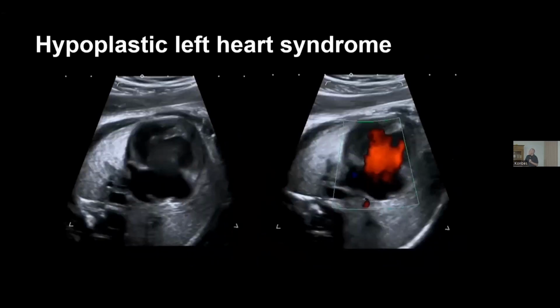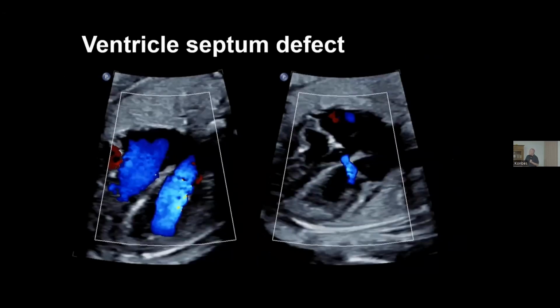Good. Some examples for ventricular septal defect. If we use color Doppler, it is important to look for the function. We have to reduce our gain and look for an optimal pulse repetition frequency, PRF. And if we have a good technique for the depiction of the color, then we can see small defects of around 2-3 millimeters. This is a ventricular septal defect.